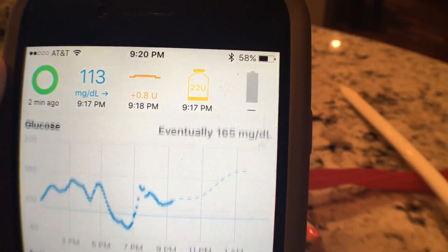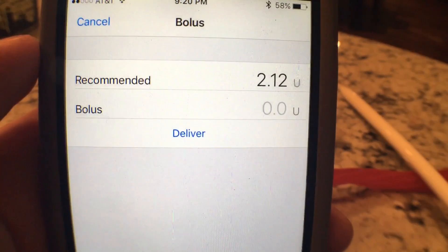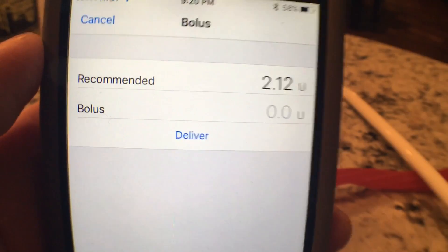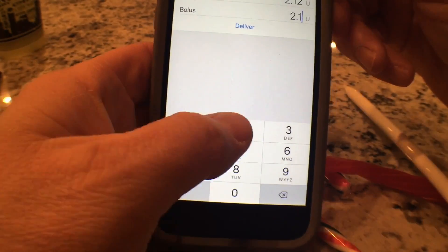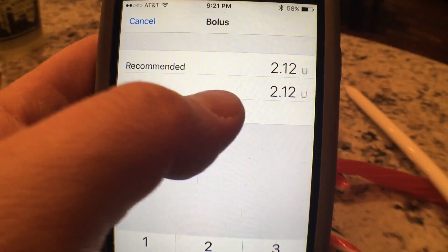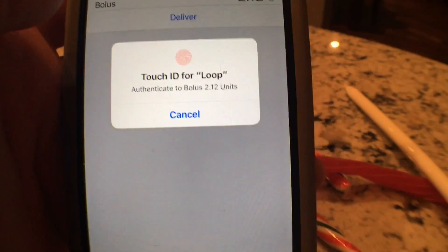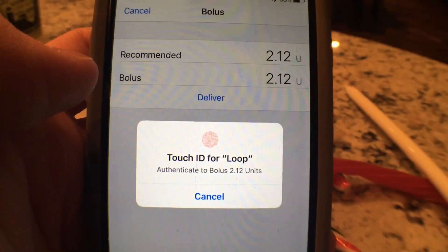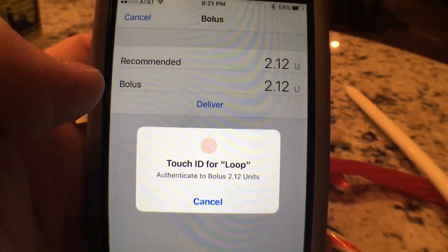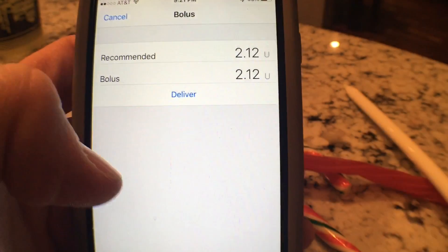As soon as I hit save, it's going to recommend a certain amount of insulin. You notice it is recommending 2.12 units of insulin. If I put in 2.12 units and hit deliver, it's not going to do it unless I put my fingerprint down here — it will not give me the insulin unless I do that. So I don't actually even touch my pump anymore. I do all of my bolus and all of my insulin right here from this app.